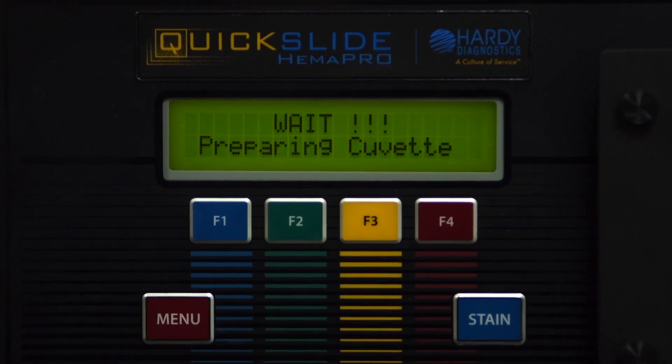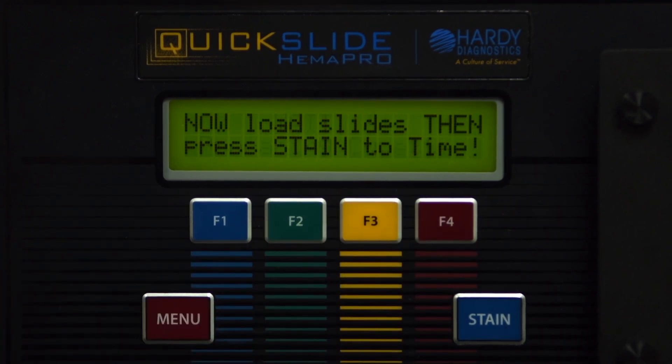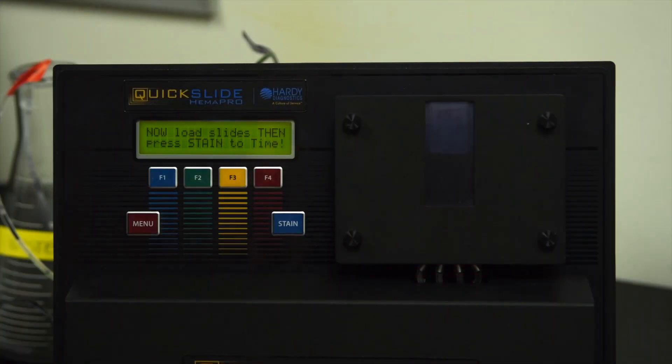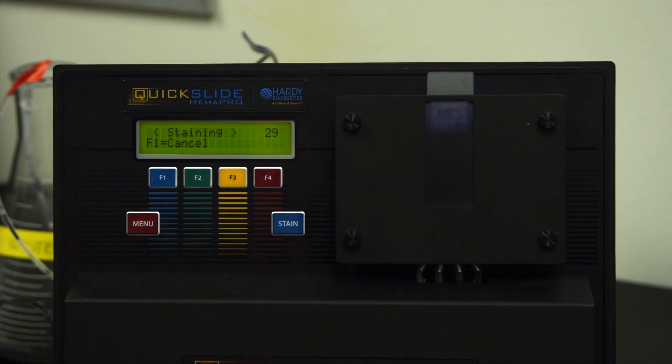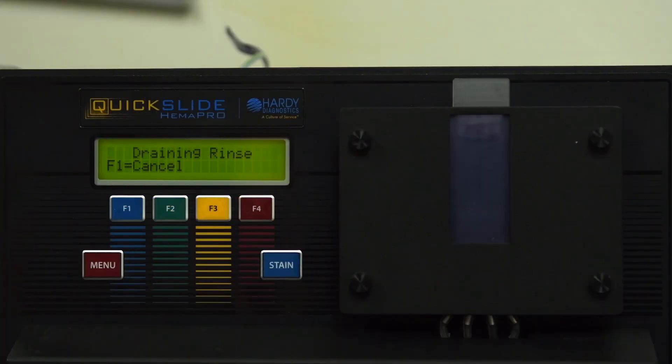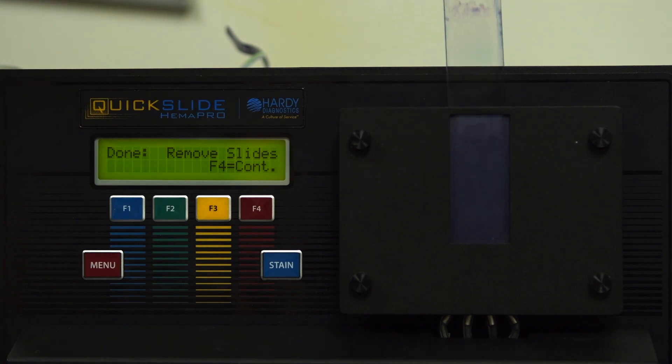Once you choose the desired stain procedure, the cuvette will be prepared. When prompted by the instrument, load the slide with the specimen facing out towards the front, then press Stain. Once the stain procedure is completed, remove the slide and press F4 to continue.